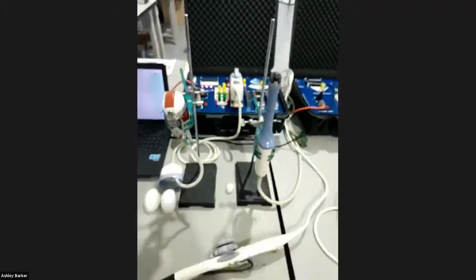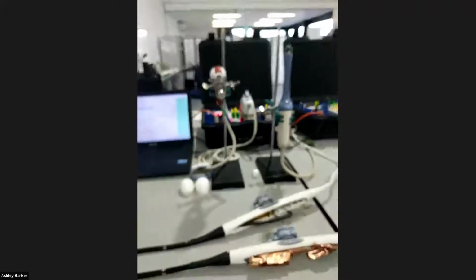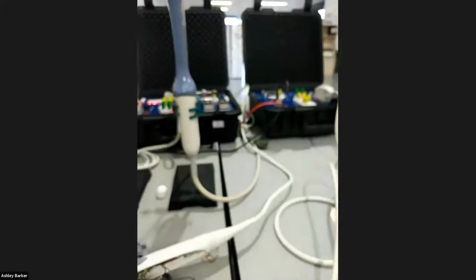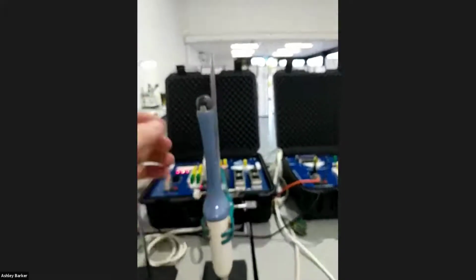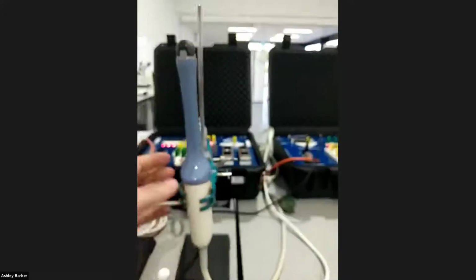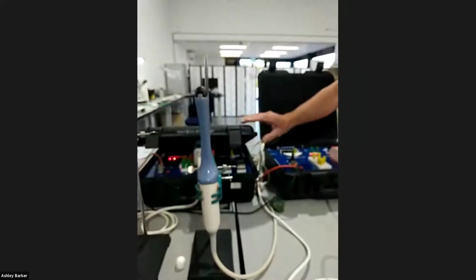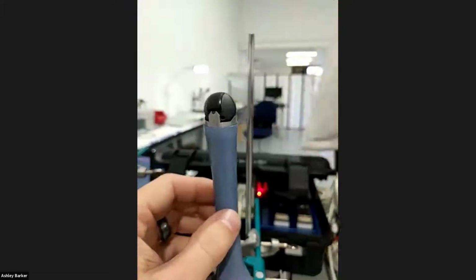Yes, it's not going fast anymore. It does this sort of cycle it goes through. I'll talk about the other one first, and hopefully this one will go back into a fast mode. So this is a transvaginal. Actually, Alan, can you just close that box? I think the white background might show better. Yeah, I think so. Oh, there we go.